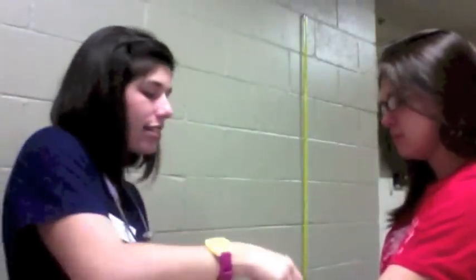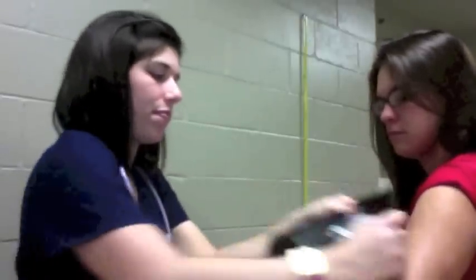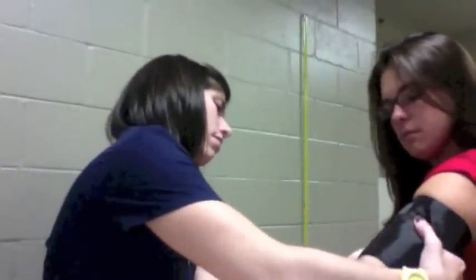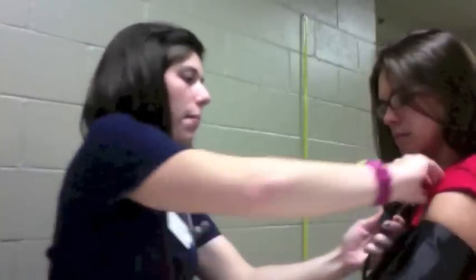Blood pressure. I'm going to ask you to put your arm up at heart level with it on the table, palm up. I'm going to ask you to uncross your legs, and I can measure the cuff size. This needs to be 80% of your arm, which is good. This side goes against your brachial artery — I lined that up. Leaving one finger and two fingers up. I'm going to use the diaphragm side of my stethoscope and place it right by the brachial artery. I'm going to find your radial pulse.